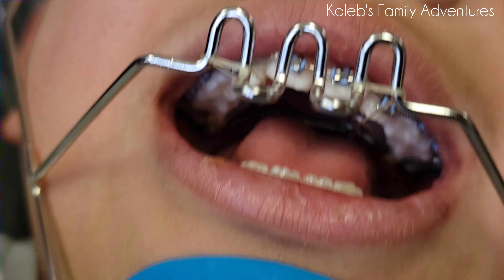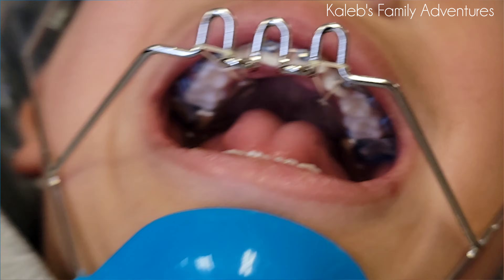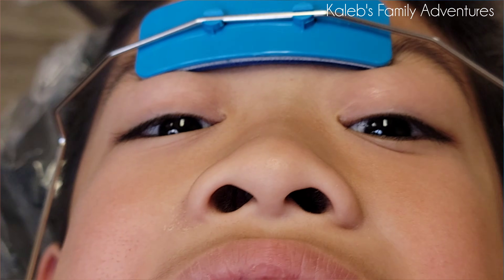Open wide, let me see where it's hooked — open wider. Oh okay. Oh, and that thing.